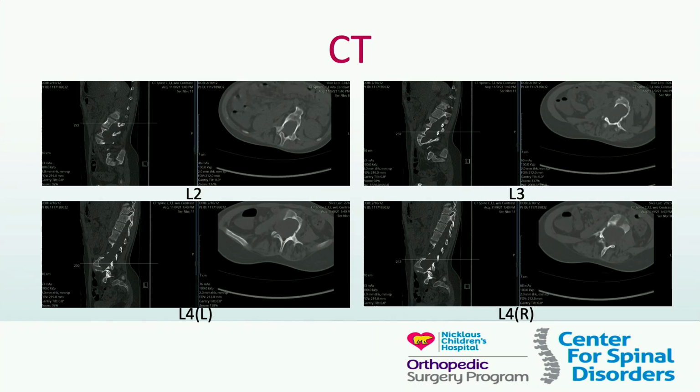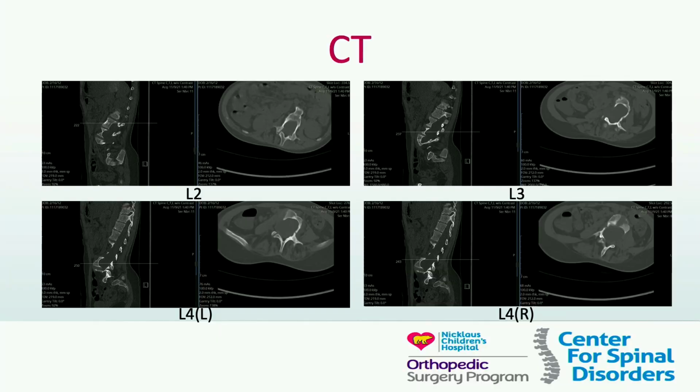What actually is going on here is there are these pathologic fractures happening in her lumbosacral region. You can see the dural ectasia, but also the thin pedicles. And what would happen is she would move and fracture the pedicle, and that pedicle would heal, and she would fracture again, and the deformity would get worse and worse. And the question is, when do you intervene, what do you do, and how do you do it?